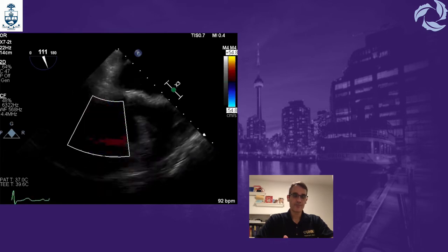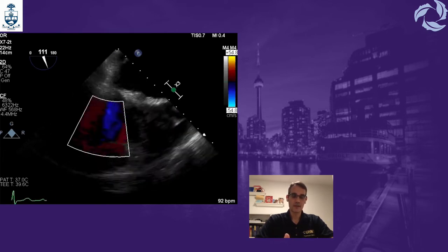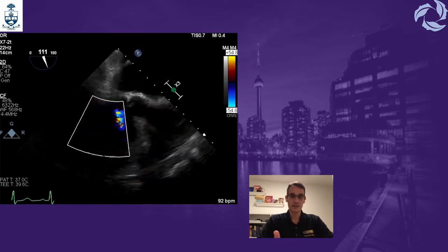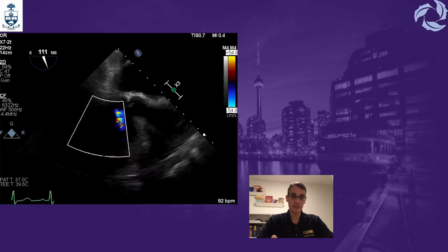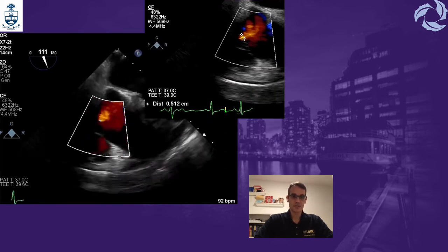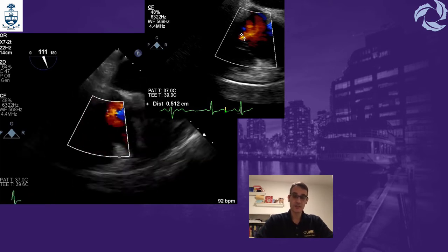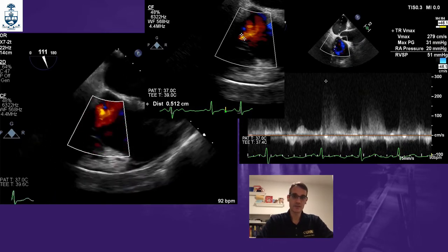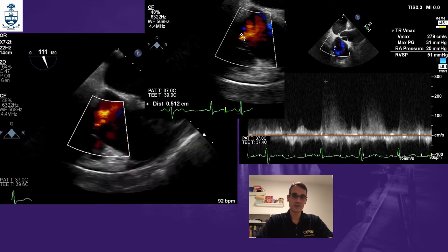Whenever we have poor right ventricular function, it's always a good idea to check the degree of tricuspid regurgitation. We knew from the pre-op transthoracic echo that there was mild to moderate TR. However, whenever you have at least moderate tricuspid regurgitation, RV function is always going to be overestimated. The vena contracta was measured at 0.5 cm, consistent with moderate TR. By measuring the TR jet, you can also estimate right ventricular systolic pressure — in this case, pulmonary artery systolic pressures were estimated at 51 mmHg, consistent with mild pulmonary hypertension.